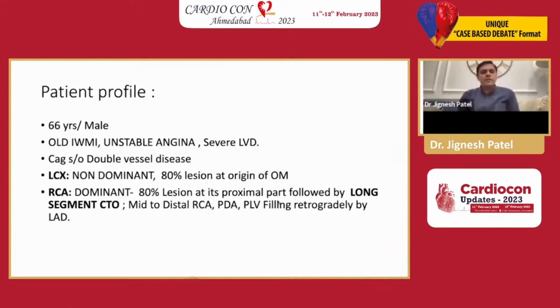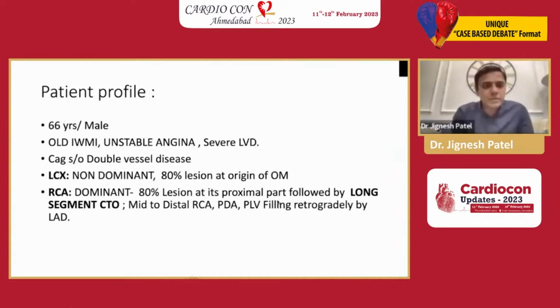This is the patient profile. The patient was a 66-year-old male with a history of inferior MI around 5 years back. Now he came with symptoms of rest angina, and echo showed severe LV dysfunction with inferoposterior hypokinesia. We did an angiography which showed double vessel disease.